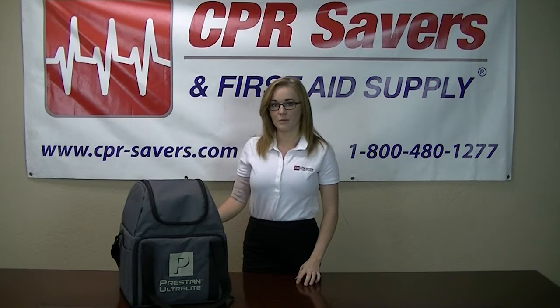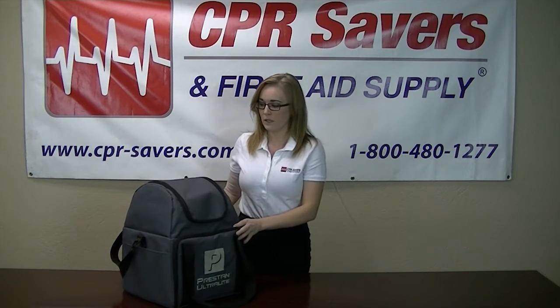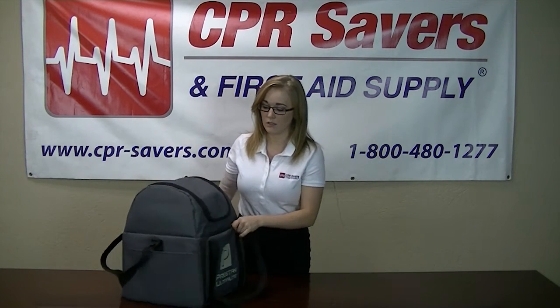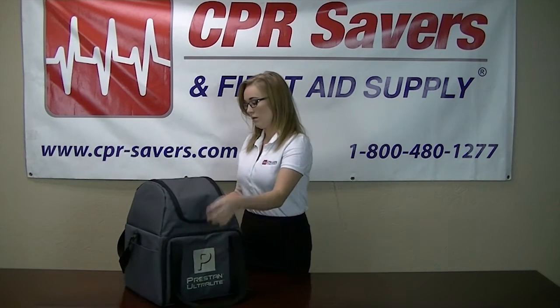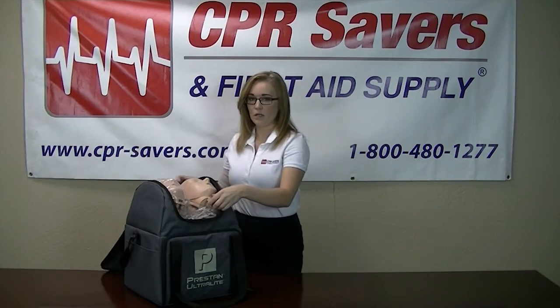Hi, my name is Lainey. I'm here with CPR Savers and First Aid Supply to demo the new Preston Ultralight Mannequin. You're going to have a four pack of adult mannequins that come complete in a nylon carrying case. Each case is going to have its own removable strap. In the top of each case, you're going to have the four mannequin heads.